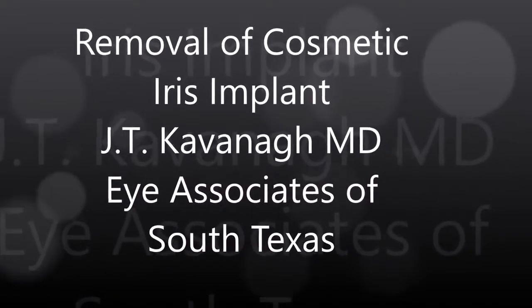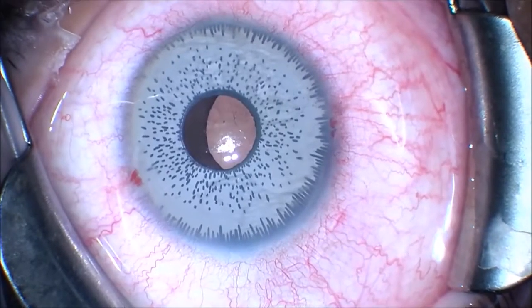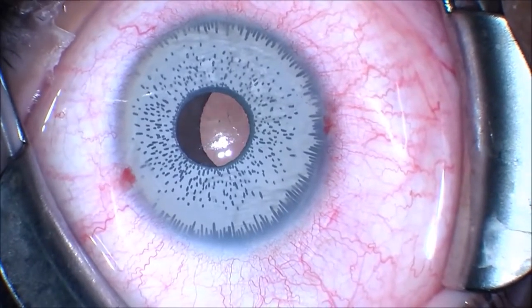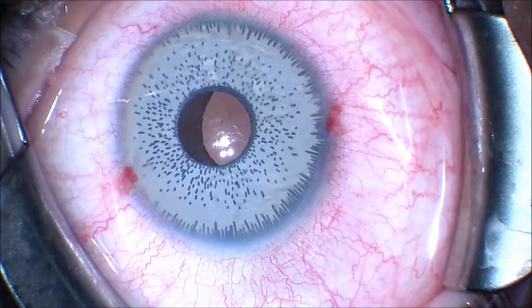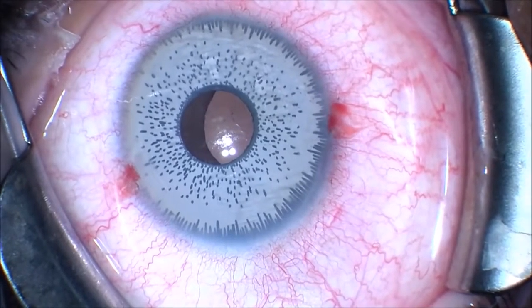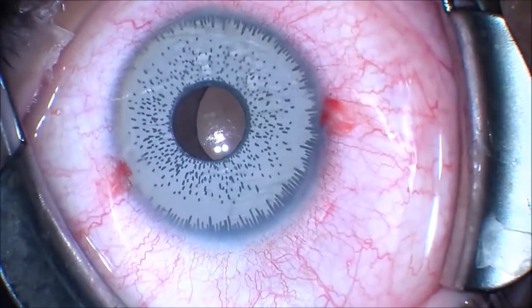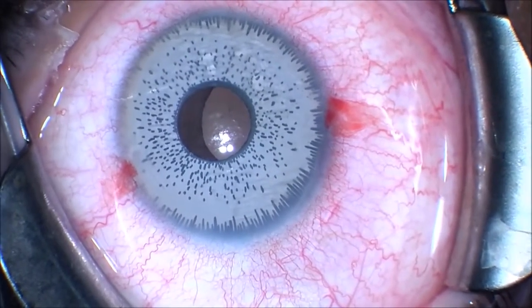I'm going to show you a case of a patient who had a silicone iris prosthetic lens implant placed in Dubai, outside of the United States, who presented with this brightly colored silicone prosthetic iris implant. You can see that the pupil is mal-shaped and not centered in the eye underneath the prosthetic iris implant.